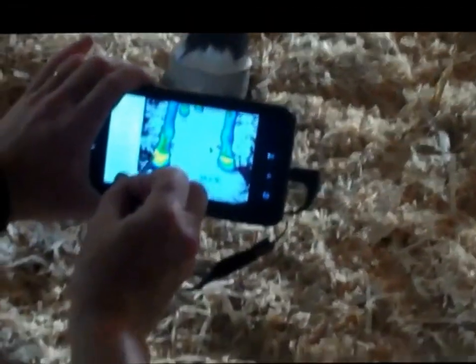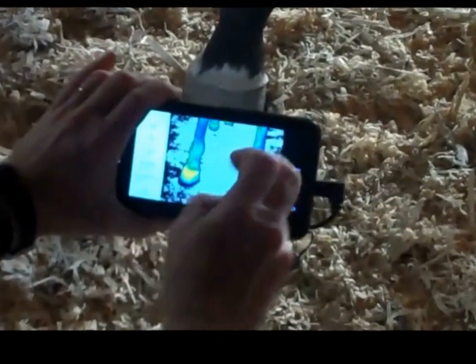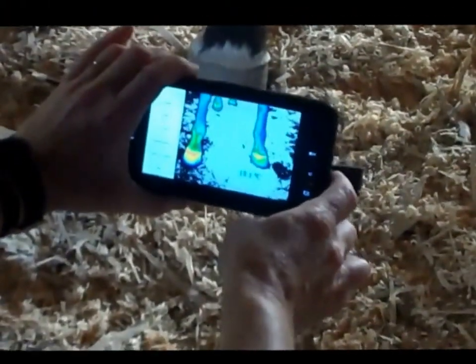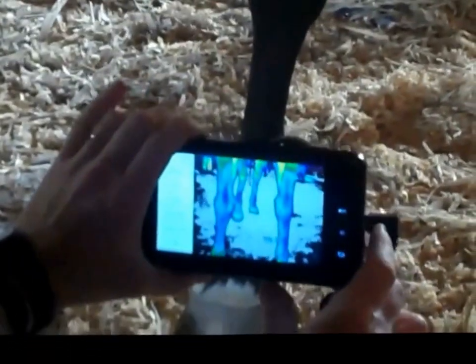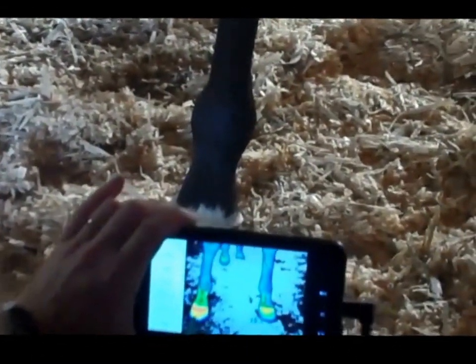The camera always shows the hottest part first. We can see he's got more heat in this foot, and there's a lot of yellow coming down his foot here. That can indicate he's eating too much grass, which is increasing the circulation. We can go up further and have a look at his knees — the heat is coming up here.